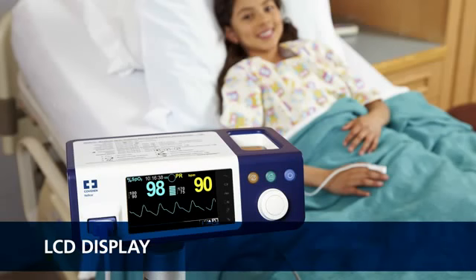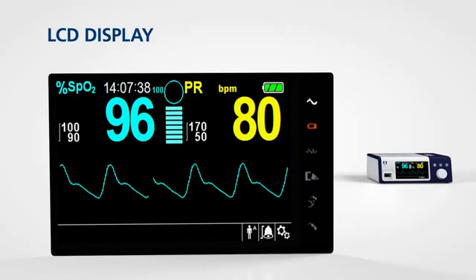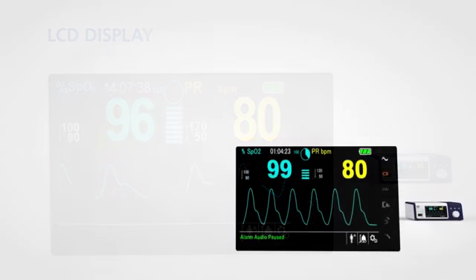The color interface on the monitoring system is designed to be both easy to read and easy to use, so you can see critical patient information quickly. Key parameter measurements are displayed prominently. They are readable from any angle and lighting situation. This readability supports normal workflow in all acuity settings.